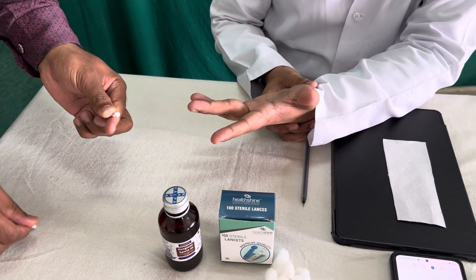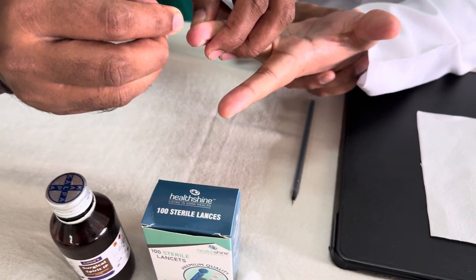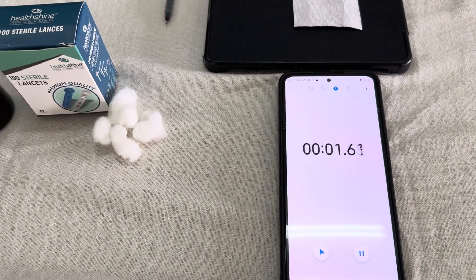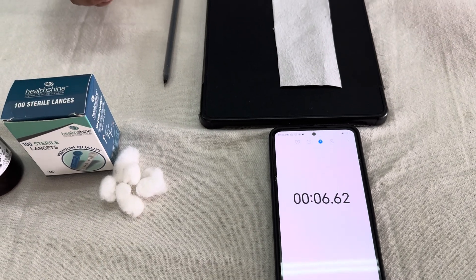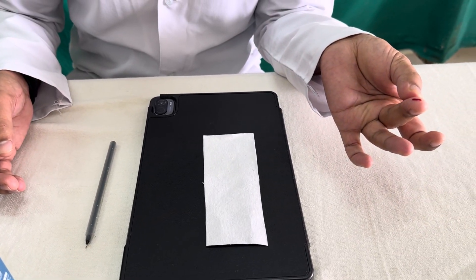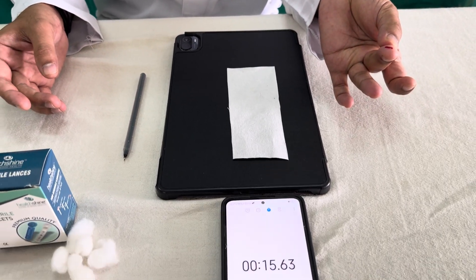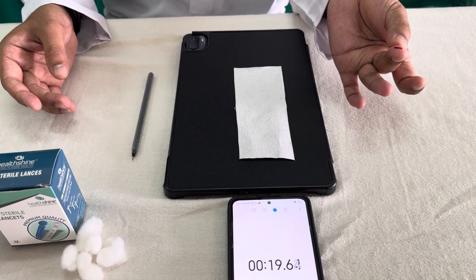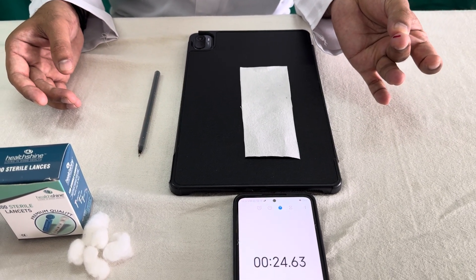You should wait for some time to let the site dry up. Then immediately when you puncture it, start the stopwatch. Within 30 seconds you need to blot the drop of blood which is coming out of the incision. You can see there is a drop of blood coming — you should not squeeze it. It should come spontaneously. Within the next 30 seconds, just blot or just touch the fingertip to the blotting paper.